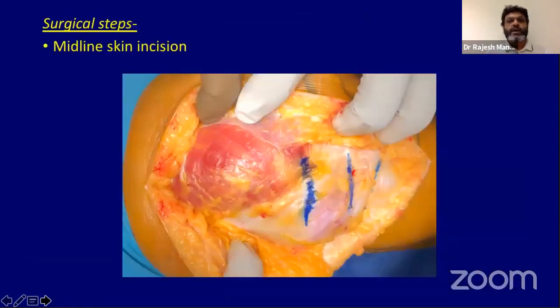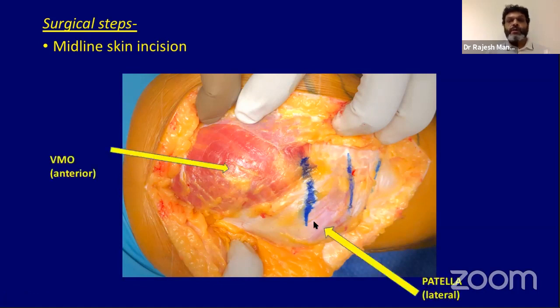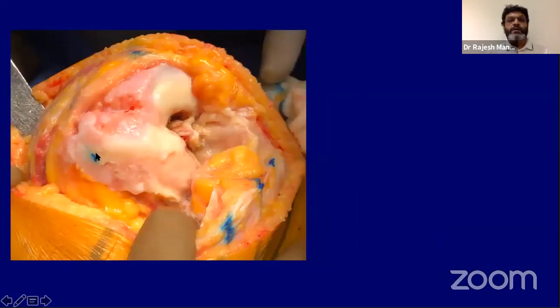Most important finding, as I opened the joint through a midline skin incision, with the idea of a medial parapatellar approach: this is the VMO, sitting in the front, not on the medial side. And the patella was sitting here, laterally. So I proceeded with my medial parapatellar. And you can see here where the patella was articulating.